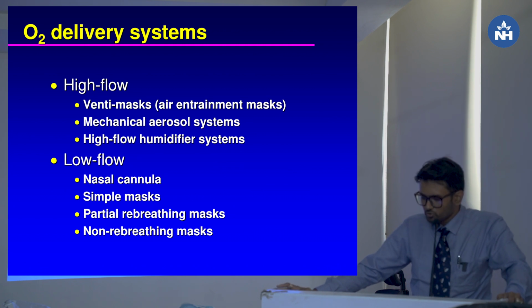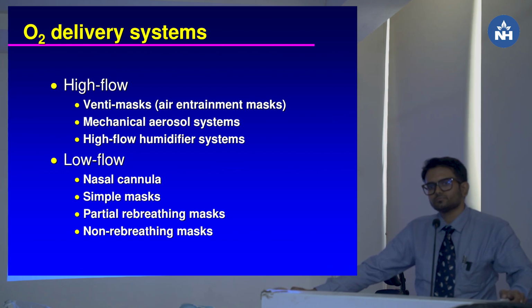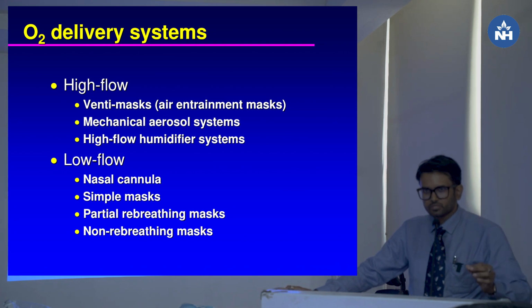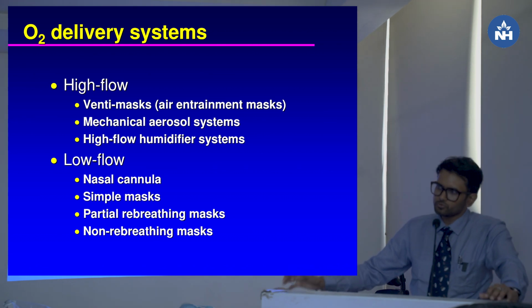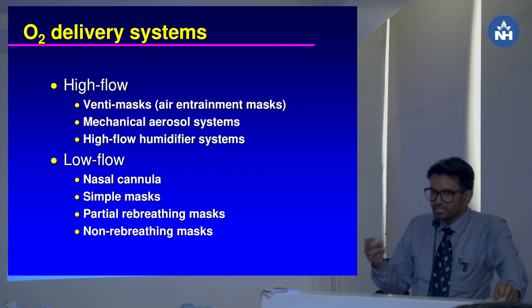Regarding the duration of use of the mask, when we understand we have to change it: actually all are disposable, particular for one single patient, one item for one patient. There is no clear-cut rule that we have to use it for a particular number of days. It's all as per logistics.